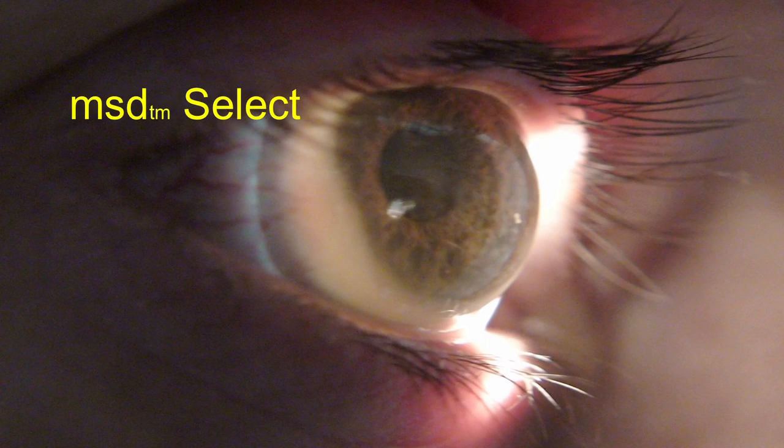Lenses that fit beyond the limbus — these are lenses that are going to allow you to vault to successful levels for your gas permeable lens patients, for your specialty lens patients. In particular, we're discussing the MSD design lens that is manufactured and distributed by Blanchard Contact Lens.